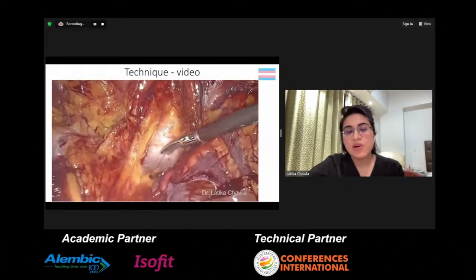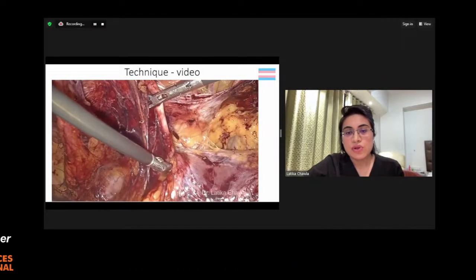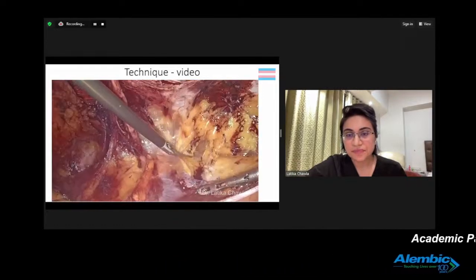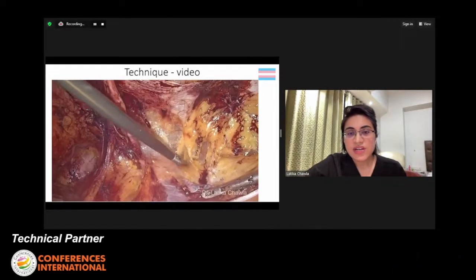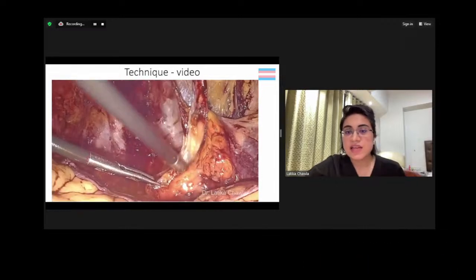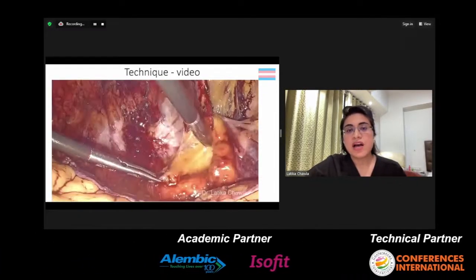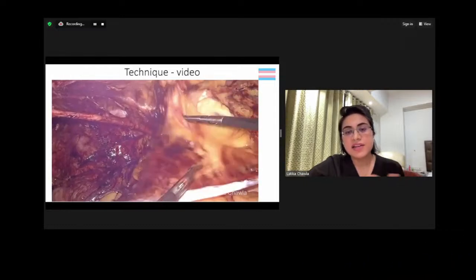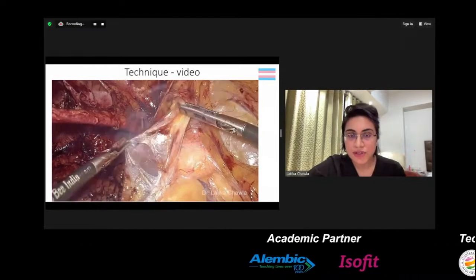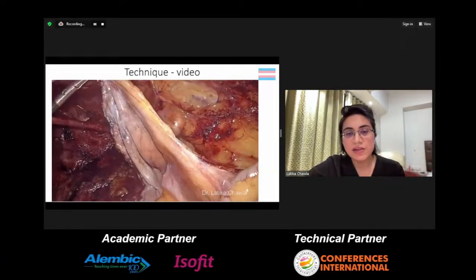And as we go down, we also lateralize the ureter. We are able to look at the ureter from the intraperitoneal aspect when we are dissecting. Centrally, when we dissect, we reach at some point the dome of the bladder. Now, this is why I was saying it's important to remain below the median umbilical ligament, because if we are going in the plane behind it, we will end up going into the space of Retzius and dropping the bladder off, which is not what we want to do. We want to remain anterior to the bladder.